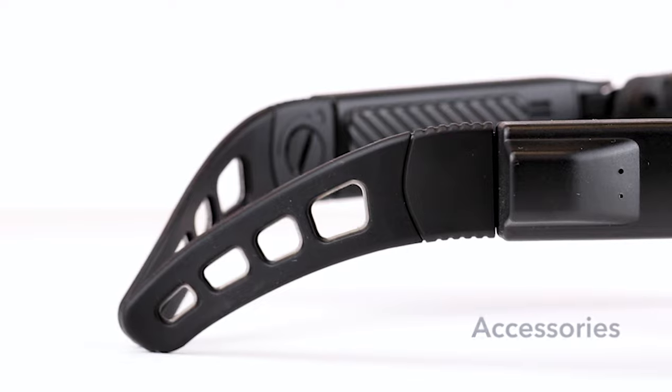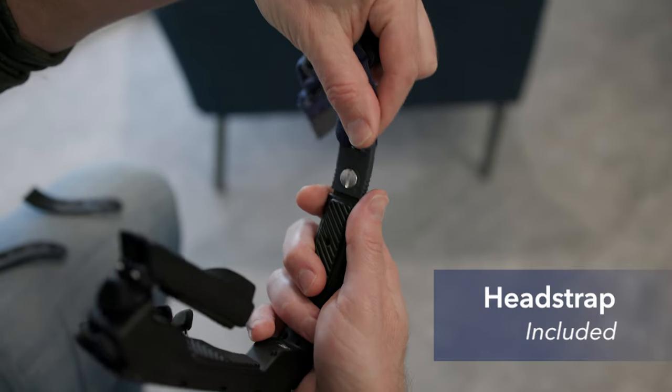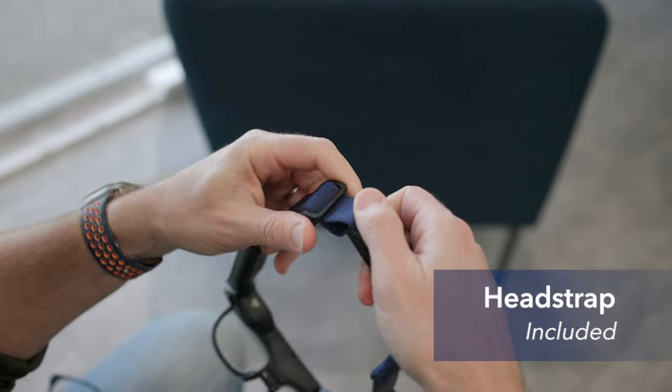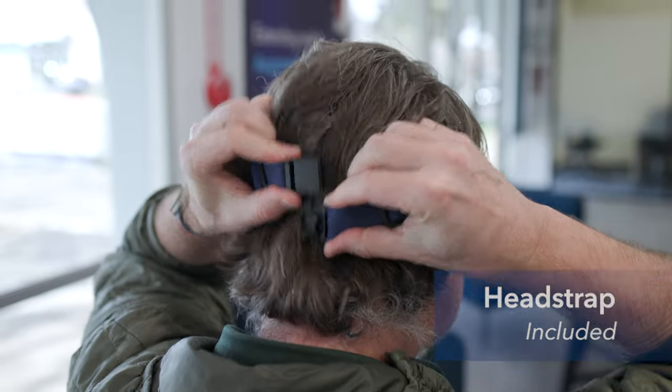The ear horns can be swapped for the included head strap using the same adjustment tool. Once it's tightened and comfortable, use the magnetic buckle for easy removal.